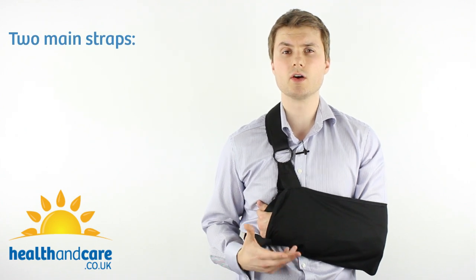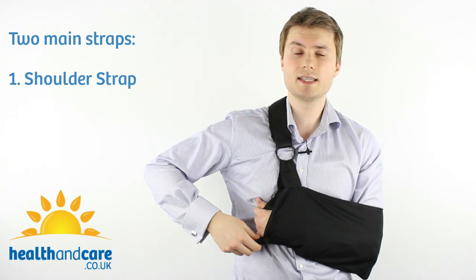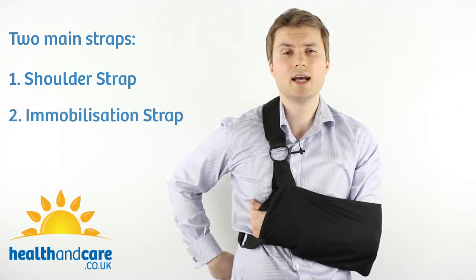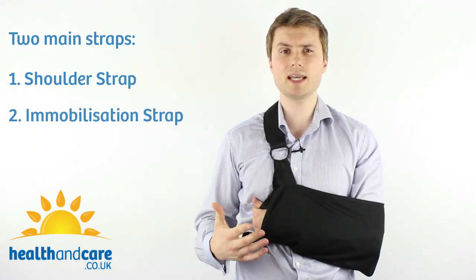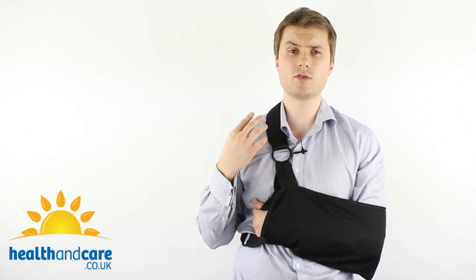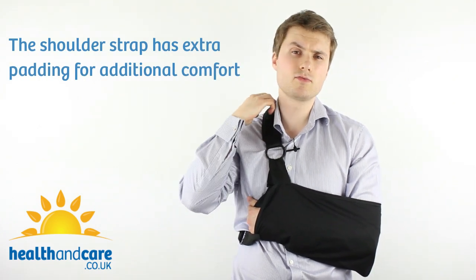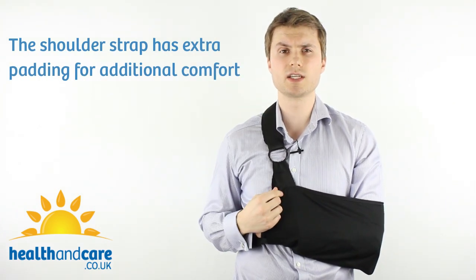There are two main straps on the ProCare Clinical Shoulder Immobiliser. The first is the shoulder strap and the second goes around the waist — that's the immobilisation strap that keeps the arm close to the body. Both straps have velcro all the way across them. The shoulder strap has an additional pad for comfort, making it ideal to rest on the neck or shoulder for long periods.